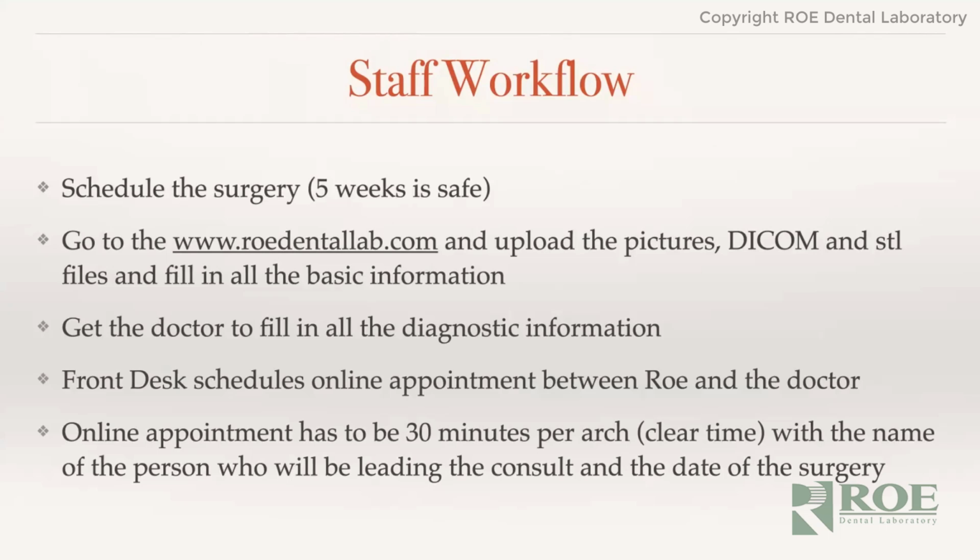It's also important that they will ask us the date of surgery. Now, a tidbit for you, whatever the date of surgery is, I always tell them at least 2 or 3 days earlier than the date of surgery. Why do we do that? Because the case gets lost in shipping, or we're going to need time for the pre-op anyway. This enables us to avoid any last-minute rushes.